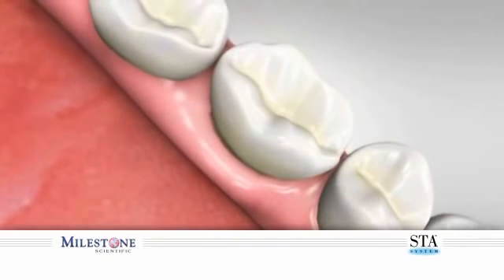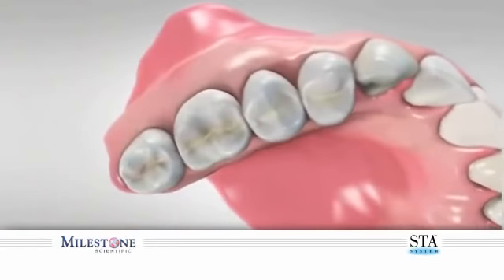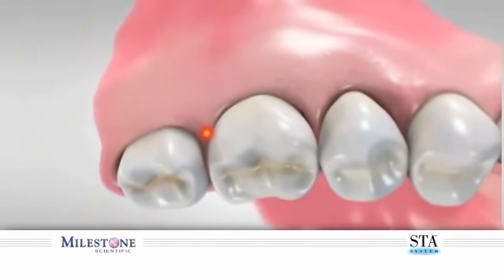Always start the injection on the distal lingual root of the mandibular molar, followed by the mesial lingual root. The injection can be performed anywhere from the lingual line angle to the interproximal contact for each root of mandibular molars. For the maxillary molars, it is recommended that you initiate the injection from the distal buccal root, followed by the mesial buccal root. The injection can be performed anywhere from the line angle to the interproximal contact area of this tooth.